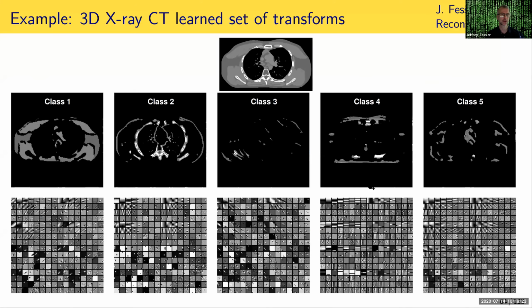And in case you're curious, this is what the different transforms sort of look like. And if you take the training data and see for each patch which sparsifying transform was the one that was selected for that patch, you can see they sort of cluster according to different regions. I wouldn't consider this a real clustering or segmentation method, but you can see there's some coherence to it.